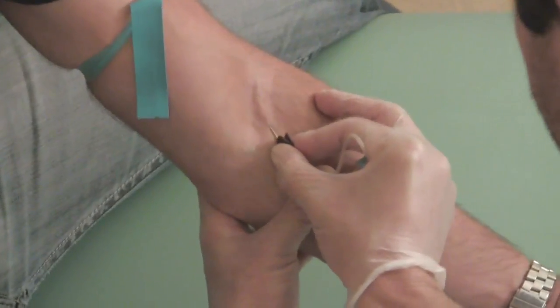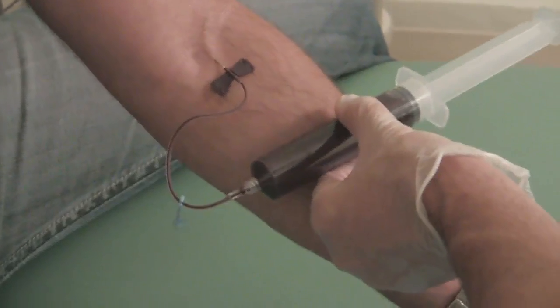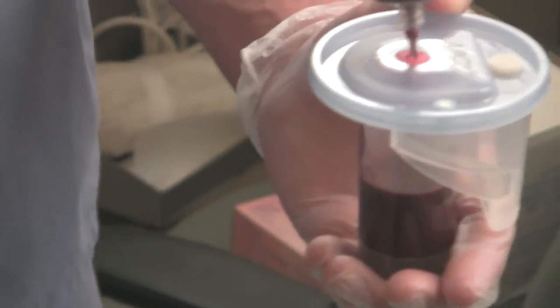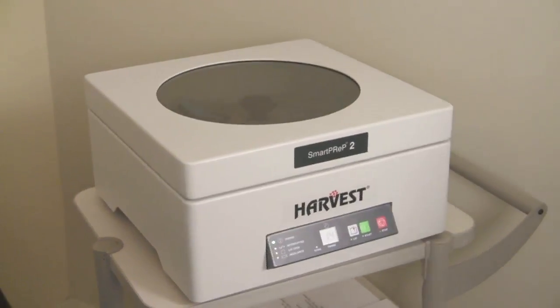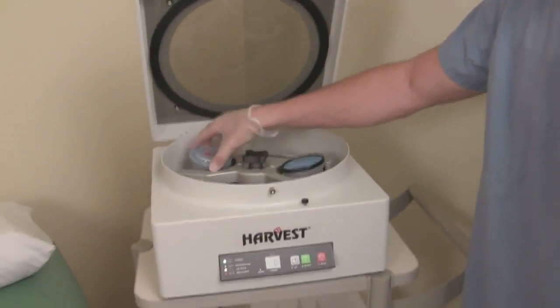My medical assistant is about to draw blood for PRP. As you can see, there's a syringe where the blood is being withdrawn into and then placed into a container, which will soon be spun, as you can see here in a centrifuge, so that the platelets can be separated from the plasma and red blood cells.